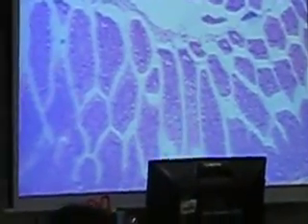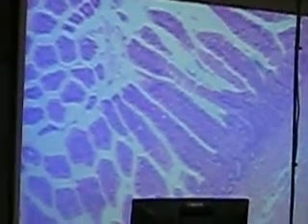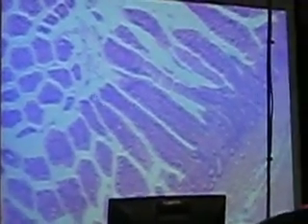The last segment is your ileum. Again, the ileum tends to have much smaller villi. You're seeing a bunch of villi fragments, and more goblet cells spread out here. If you go up to high power, you'll be able to see a lot more goblet cells. Also, when you look at the ileum, you're going to notice this big mass out here.